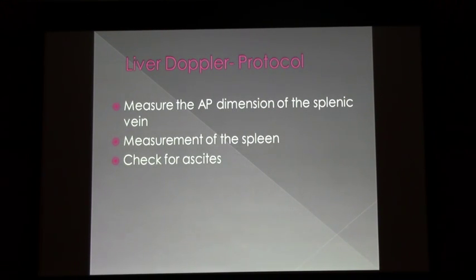And the size of the splenic vein doesn't matter. I've noticed that a lot of people have been measuring splenic veins. It's part of the protocol that we have. I don't know where this urban legend comes from. You don't have to measure splenic veins, okay? So scratch that.